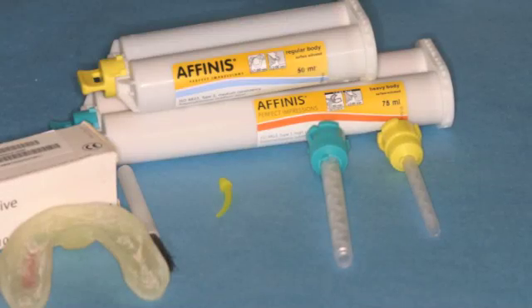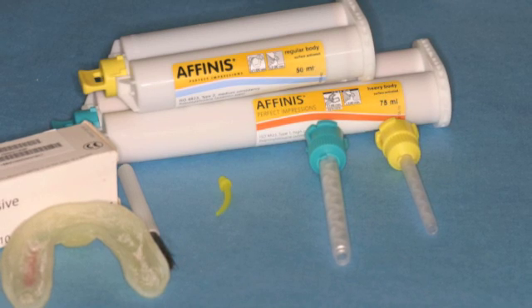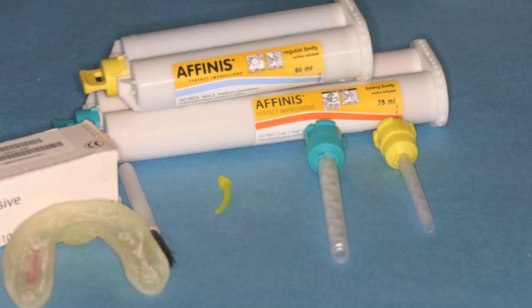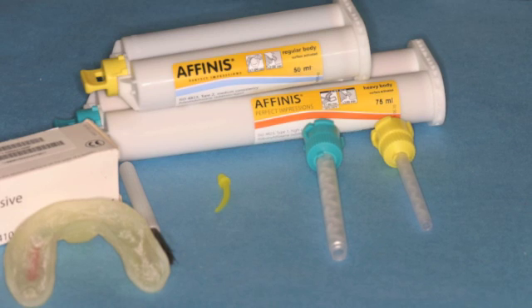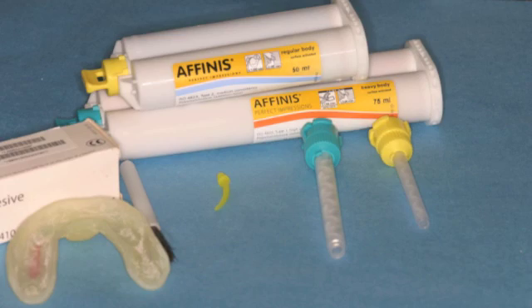making for dental crowns. Materials needed include regular or light body PVS, heavy body PVS, auto-mix tips for light and heavy body impression material, small tip cannula for light or medium body PVS, tray adhesive, and a custom tray from SteadyCast.